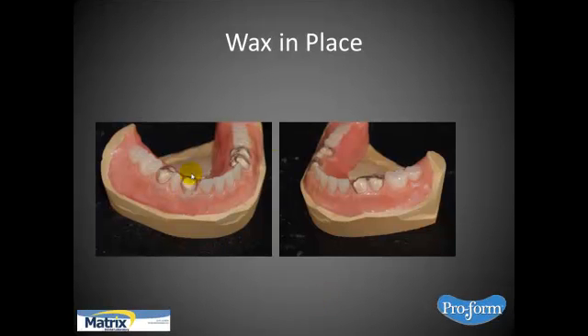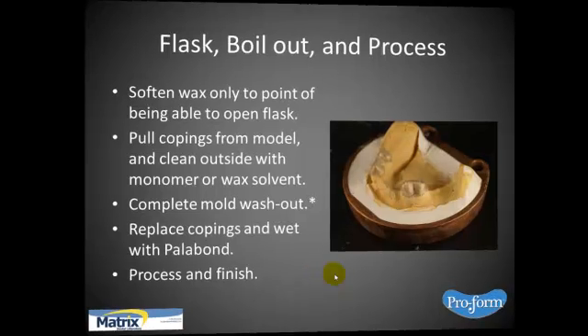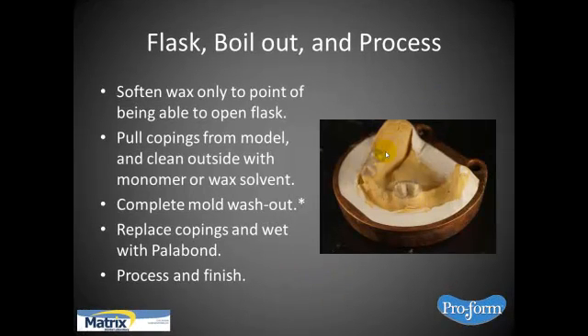Once everything's in place, wax it all in final, get it to where you want it, then go with your processing technique. For me that would be the flask technique — others will use pour and others. Whenever you do mold adaption with acrylic, make sure you leave the copings on at all times, because you don't want anything to run up underneath. Soften the wax only to the point of being able to open the flask — you don't want to subject these to a great deal of heat because they will deform. If you let the wax get too liquid, it soaks into your model and you'll never get it out.